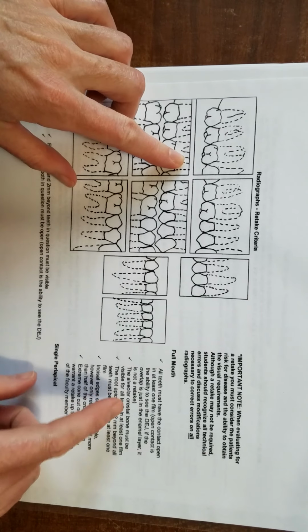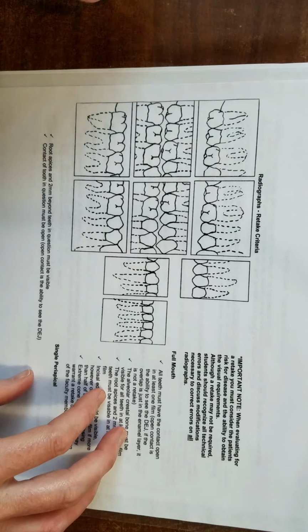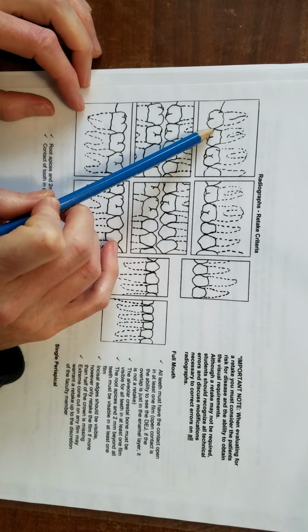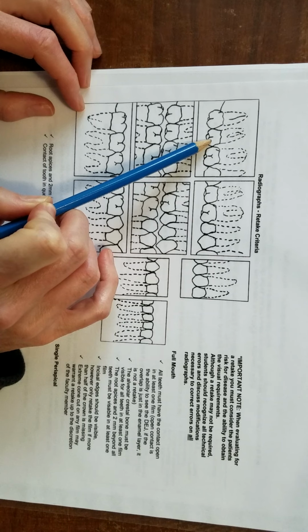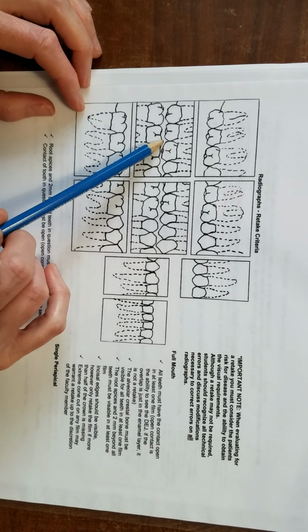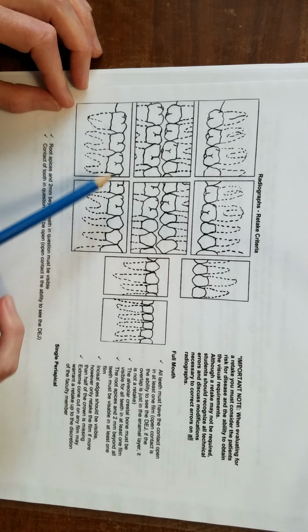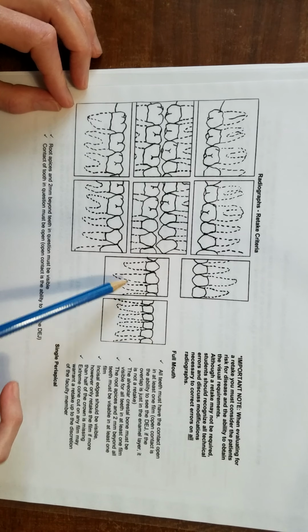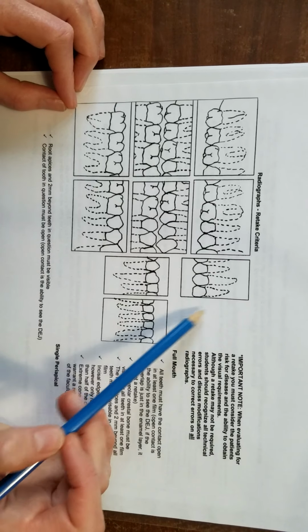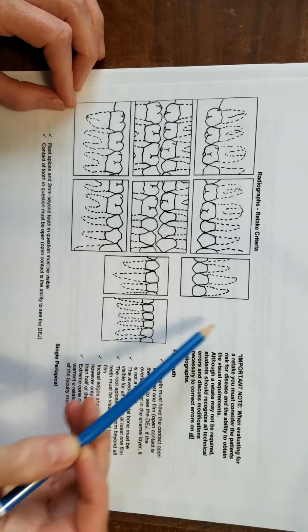So this form is hanging up in the radiology in every operatory. This shows the teeth that, in an ideal situation, should be on the film. So this is your molar film, this is your premolar film, this is the canine shot, bite wing molar, bite wing premolar, mandibular molar, mandibular premolar, canine shot, and central. And I'm not sure why the maxillary central incisor, but it's the same thing as this, just the maxillary teeth.